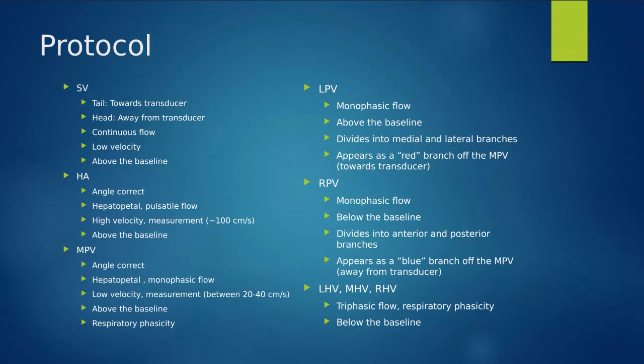Now, when you have triphasic, that waveform is going through 3 different phases. So it's going through a peak systolic and an early diastolic and then an end diastolic. So the arterial contraction is a little bit more complicated than the venous blood flow return. If we look at the examples on the left side, we have triphasic on top, biphasic in the middle, monophasic on the bottom. Now, as we said, monophasic is normal for veins.